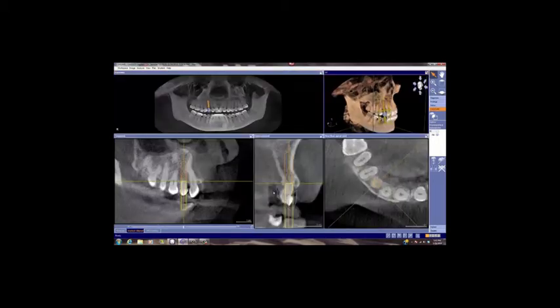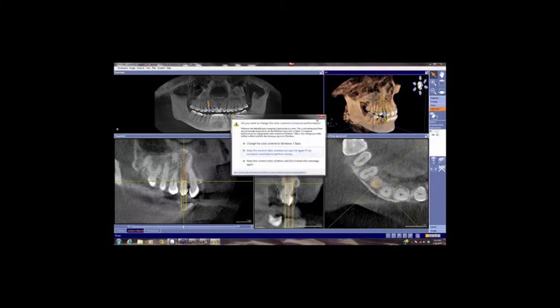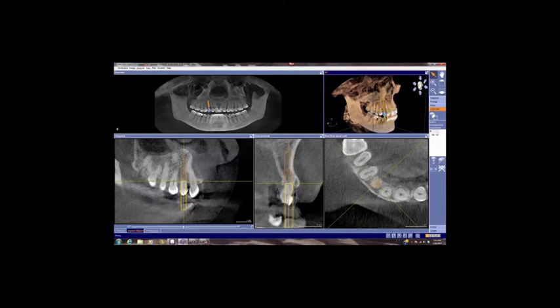Now, if we look at it closer, we could place this implant in the trajectory of the ridge. However, then the implant would exit about 25 degrees to the facial aspect of this restoration. That can obviously be fixed with a custom abutment. That is not the issue to restoratively fix that. However, if we plan it that way in aesthetic areas, then the custom abutment typically has to go through the facial to come back out, and that pressure of going through the facial a lot of times puts too much pressure on the gingival tissues and puts the gingival margins more apically.